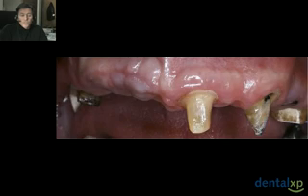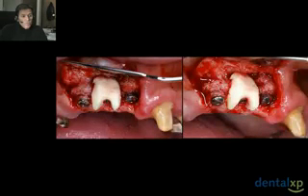And if you take a look at the left side where he retains some questionable or guarded teeth with remaining decay, you can see that the soft tissue and bone on the right side has been compromised both horizontally and vertically. What we attempted to do in this case to attain the aesthetics needed is to utilize a combination of implant placement and allograft block to support the contour of a pontic in the area of the lateral incisor.